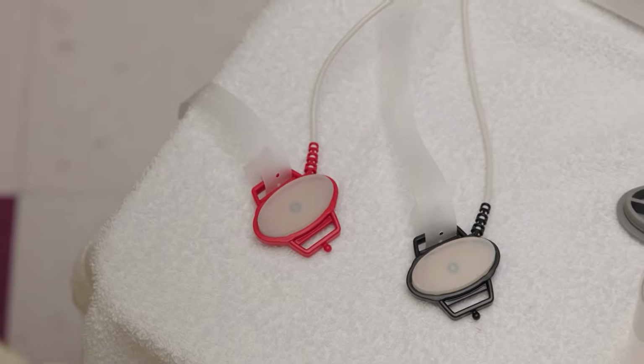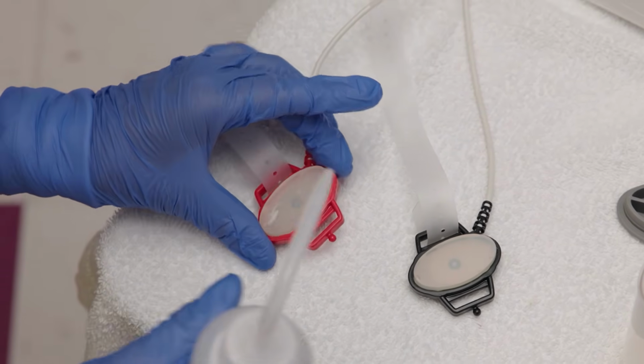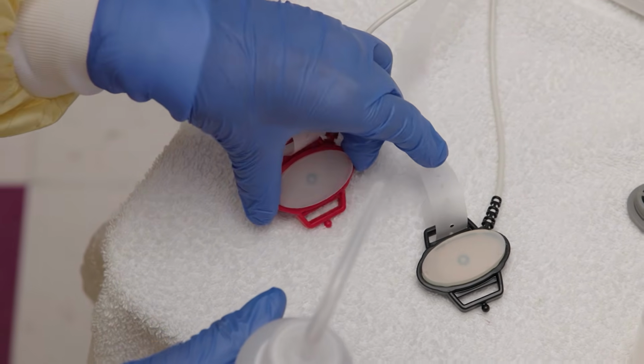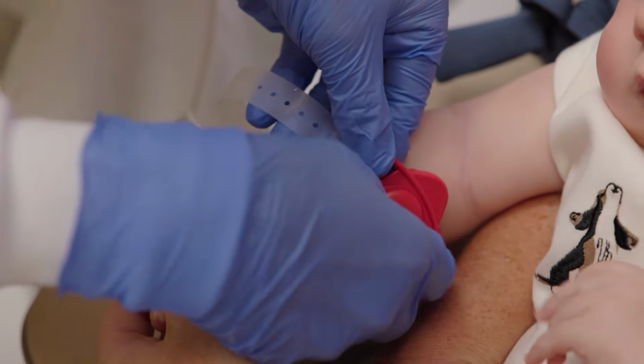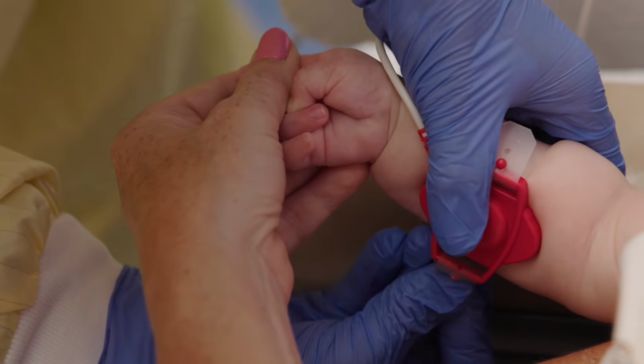The skin where the electrode with gel disc will be placed should be slightly wet, so you can either add a drop of CLRW to the skin or to the gel disc and then place against the skin. Start by placing the red electrode first. Secure the strap firmly, but not so tightly that the gel disc is crushed or circulation constricted.